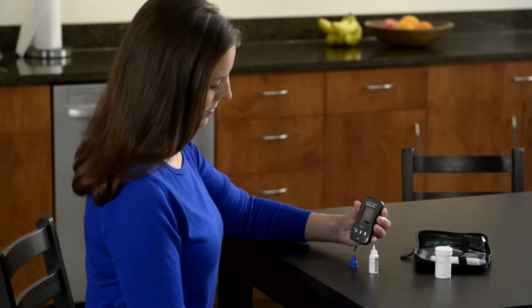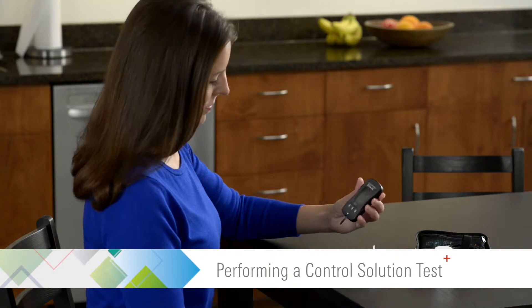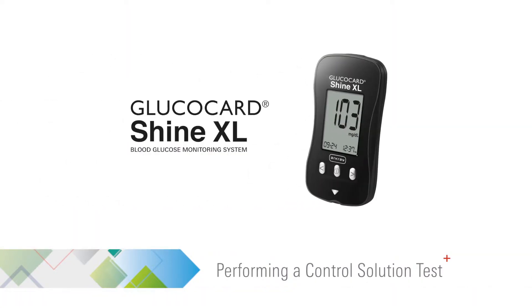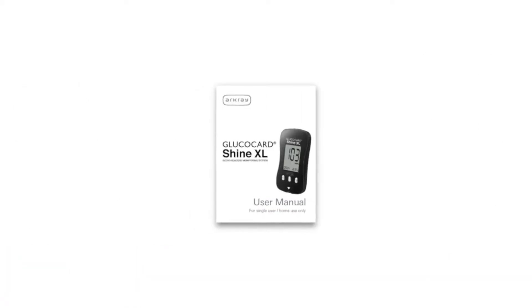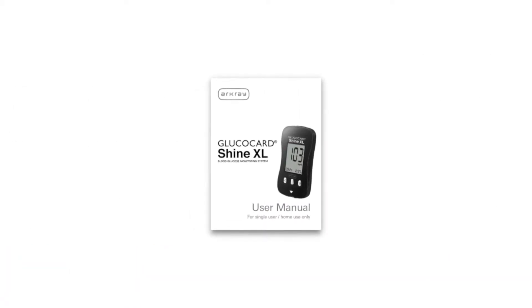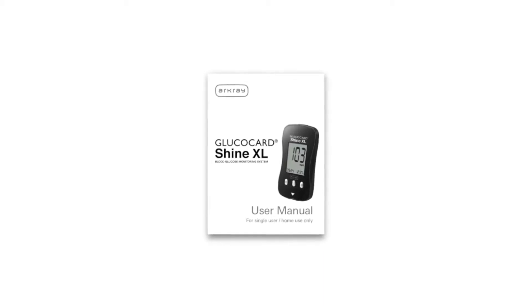This video provides an overview on how to perform a control solution test with the Glucocard Shine XL Blood Glucose Monitoring System. For complete instructions and when to perform a control solution test, please see the user manual supplied with the meter.